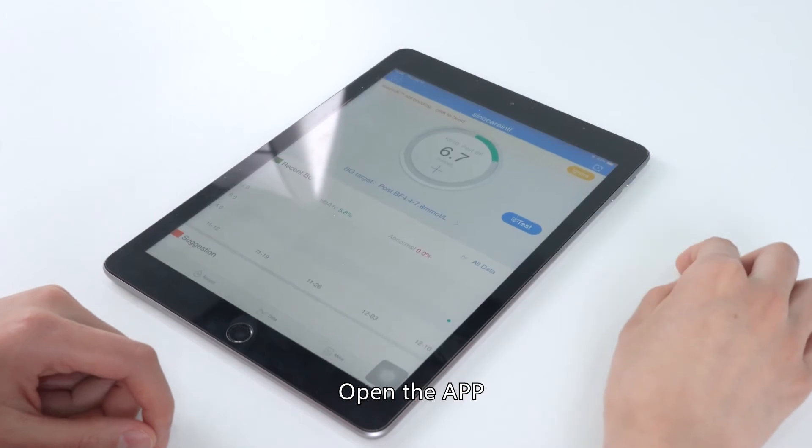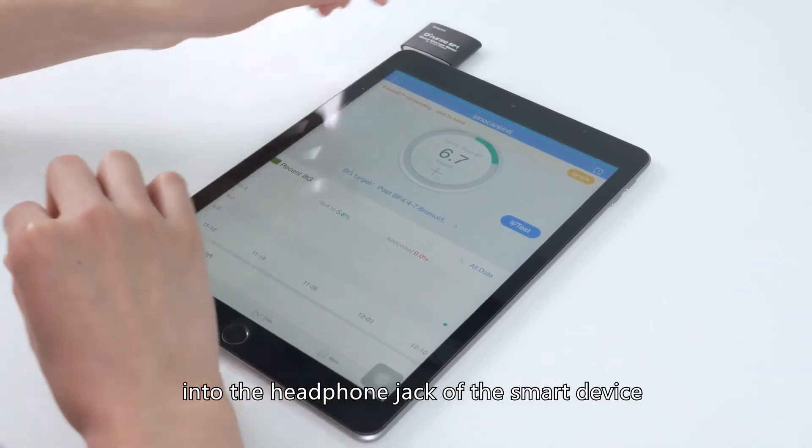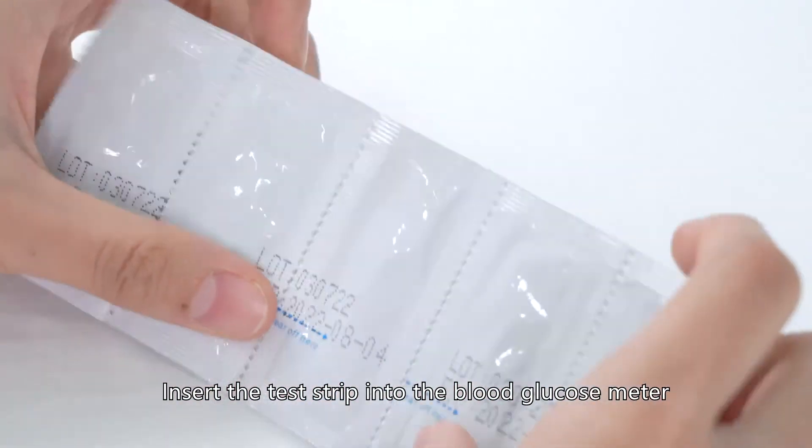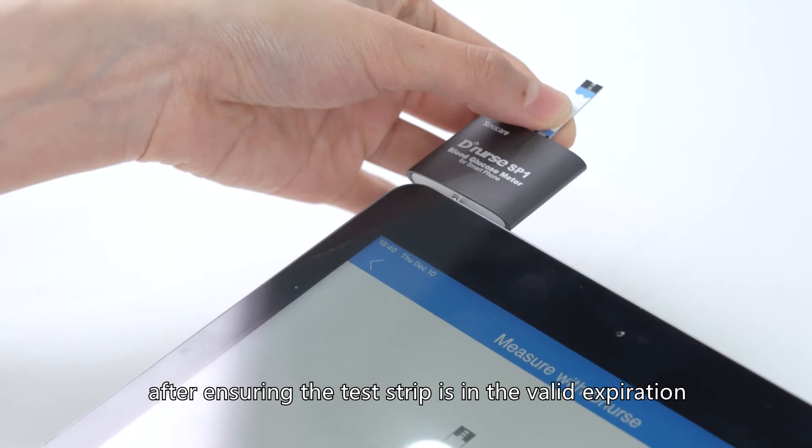Open the app. Put the blood glucose meter into the headphone jack of the smart device. Insert the test strip into the blood glucose meter after ensuring the test strip is within the valid expiration date.